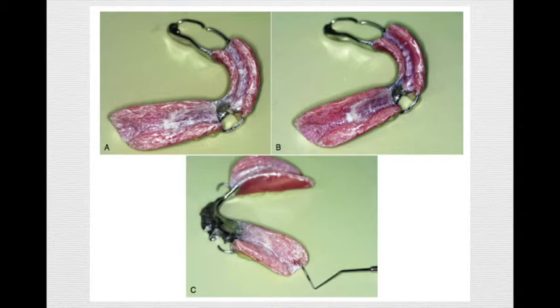When we say we should apply the PIP in a thin layer, it means you should be able to see the brush trace over the tissue surface. So you can easily detect where the show-through spot is. If you put it on too thick, it is not easy to observe, and the PIP will not really provide its full function.